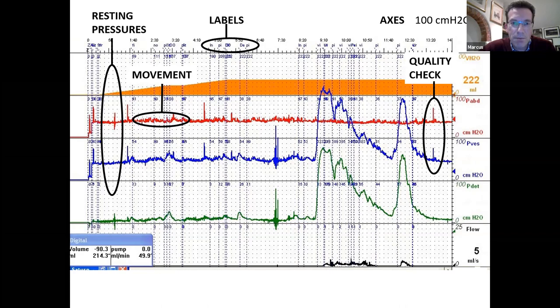So patient has moved, perhaps. Well, that's relatively unlikely. Now, transducer movement. There is an interesting point, because when you see an absolute pressure in a patient, it's not absolute pressure, it's relative pressure. It's the difference in pressure between the transducer and the patient's organ, and it will be affected if the patient moves or if the transducer moves.